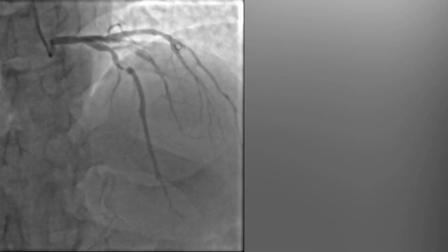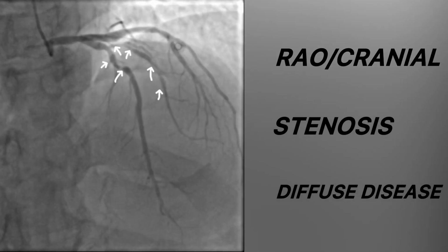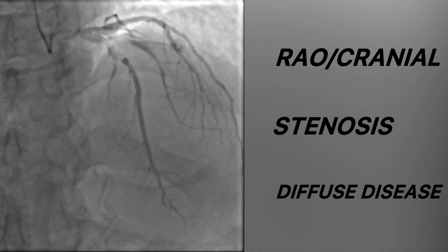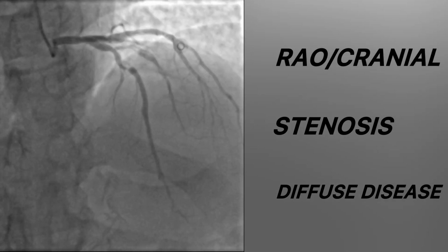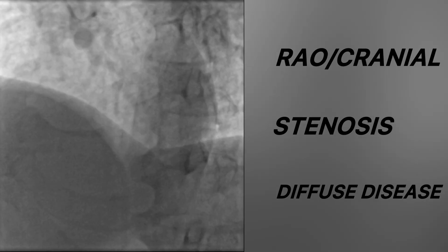Next, in the RAO cranial view, which represented the most diagnostic and critical projection in this patient, a severe high-risk stenosis in the LAD is clearly identified. This lesion carries a substantial risk and, if left untreated, could have resulted in myocardial infarction.